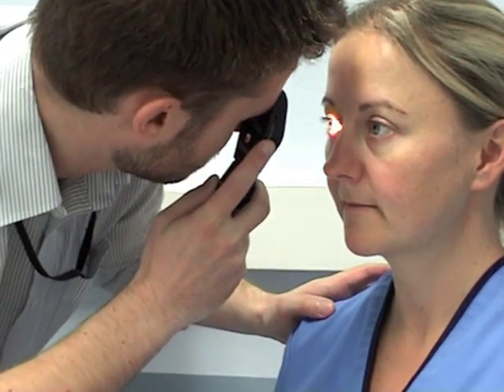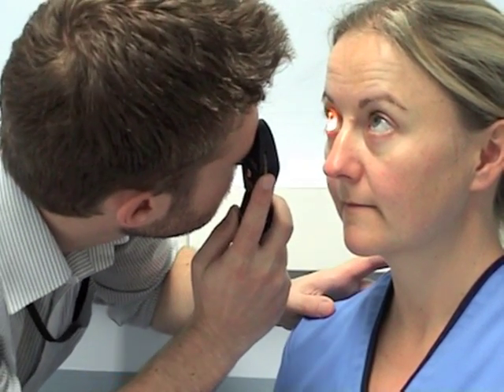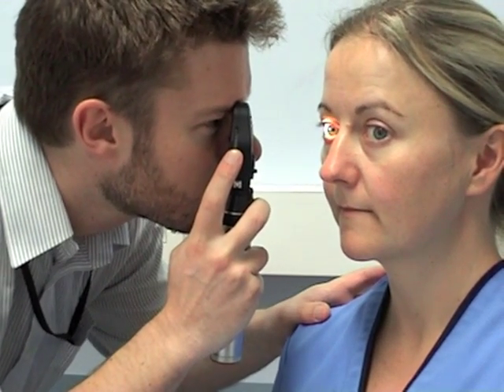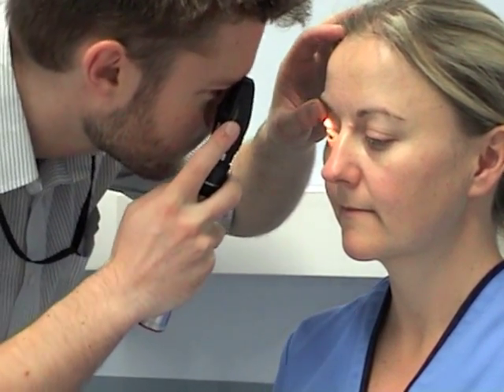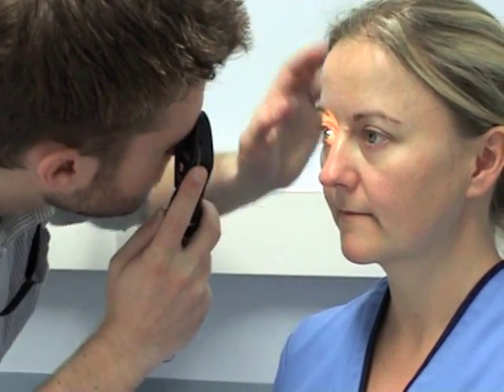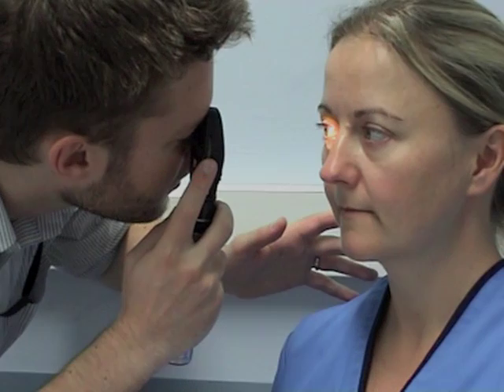The first structure usually encountered is the optic disc. Magnification is 15 times, so the disc usually fills an undilated view. If the disc is not seen immediately, any blood vessels should be followed, as this will lead to the optic disc. Remember that the V created by the branching vessels always points to the disc.